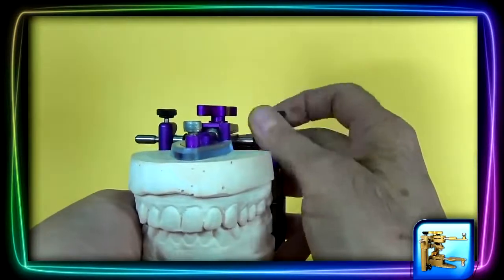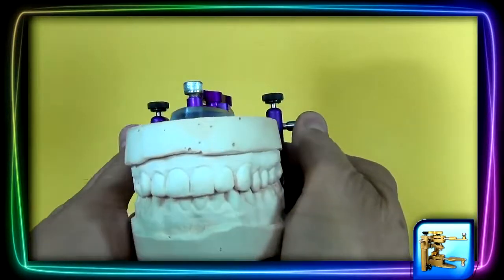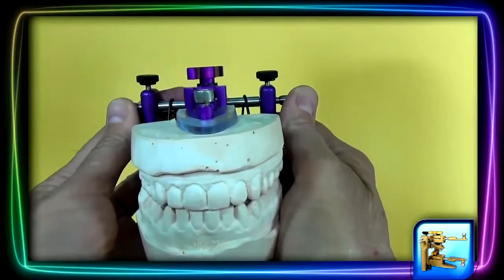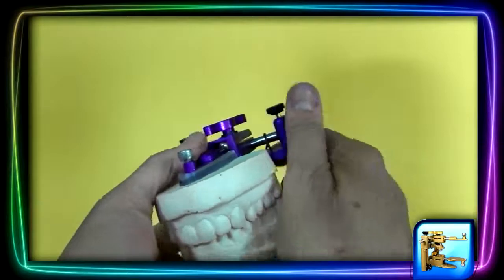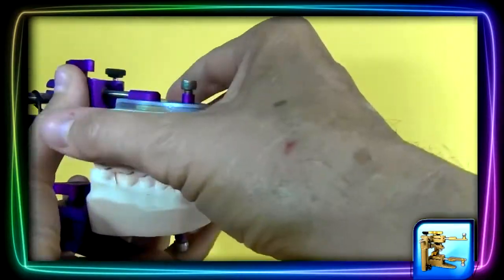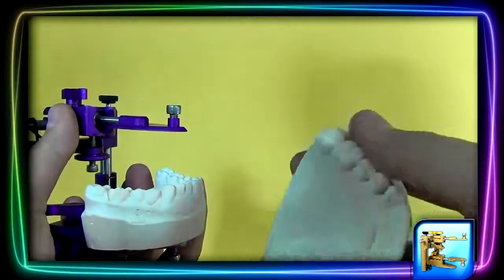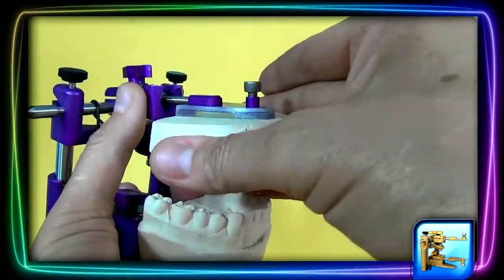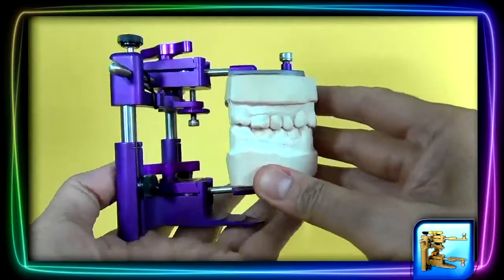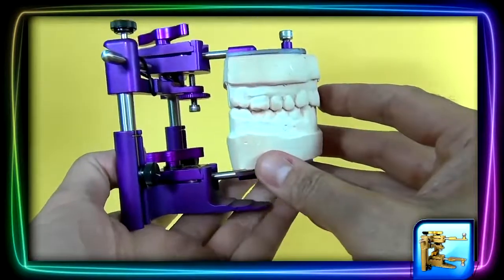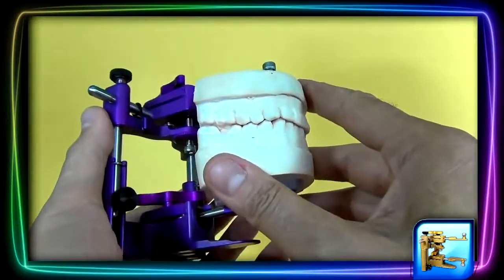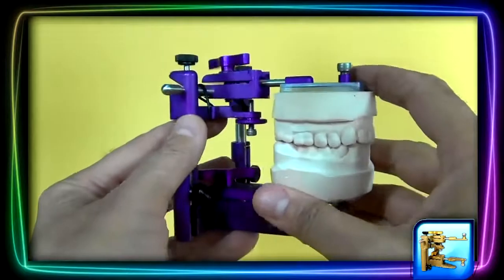As you can see, it's very fast. Here, you have your lateral excursions. Again, at the same time, you can always work off the articulator and then reinsert it 100% securely. This is also great for triple trays. If you do make a mistake and the triple tray is off, it is very easy to re-articulate it.